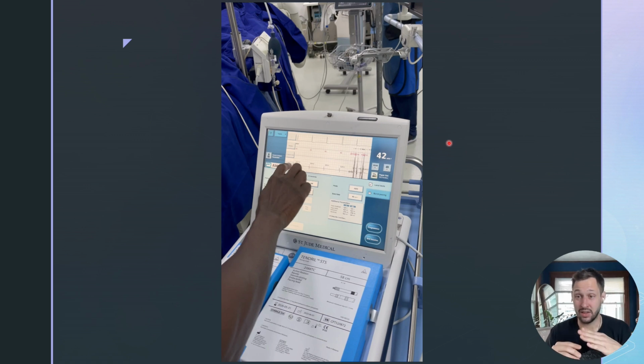Injury current. If the injury current is negative, that could indicate perforation. It could also indicate that maybe you switched your cables, right? Maybe the red is the tip, black is the ring. If you see that, sometimes physicians will do it to mess with you too. Make sure to call it out and see what's going on.